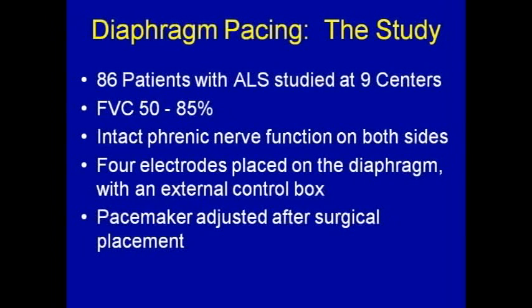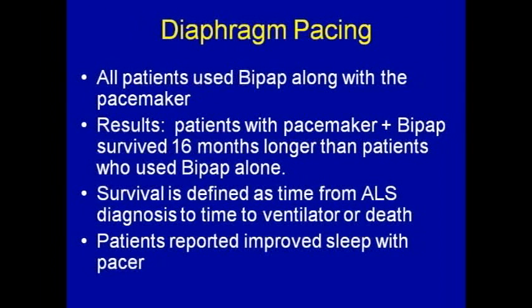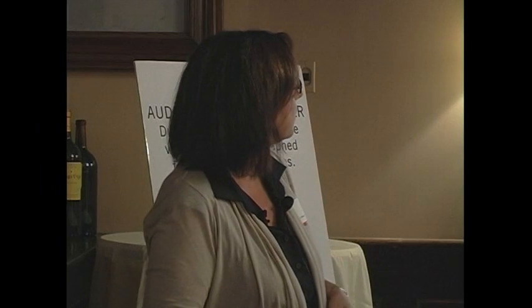There's an external control box, and then after the surgical procedure, which was pretty straightforward, it was done laparoscopically. Hardly anybody, I think one patient had a complication out of 86. It was done quite safely, which was good news. And then the pacemaker was adjusted afterwards. That was a picture of the thing.